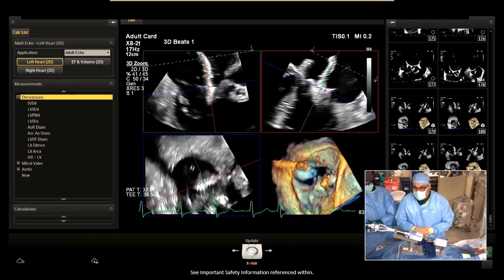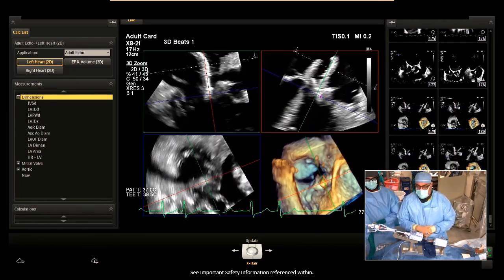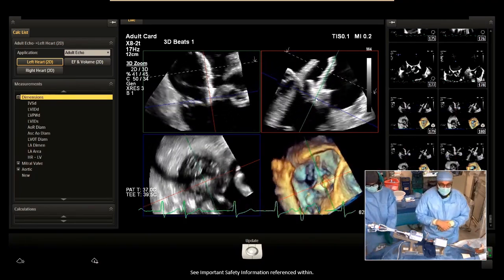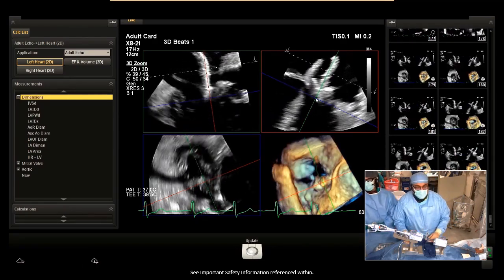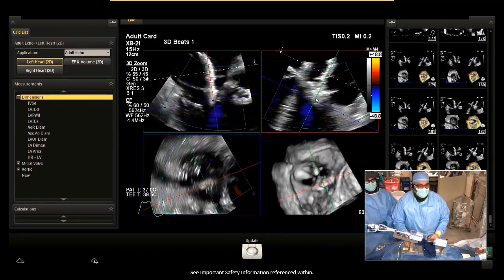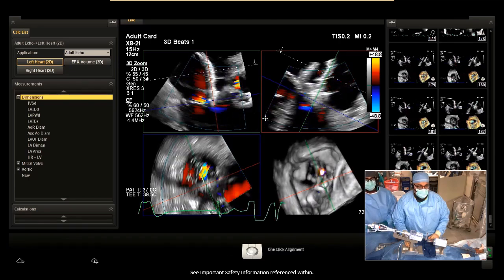Aman likes to call it, that is our true north, and it gives us the best amount of visualization. So how about we do that, Edris? That sounds great. Okay, good. So what do you think about this location? Do you want to put a little color jet here to see if we need to pull back anymore? So it looks like we're right close.